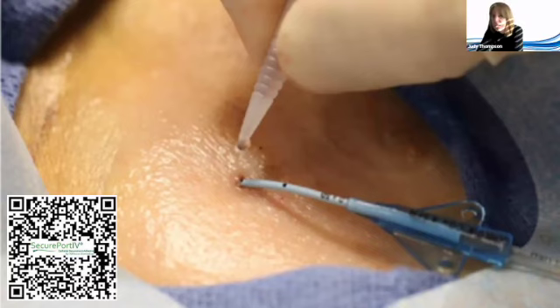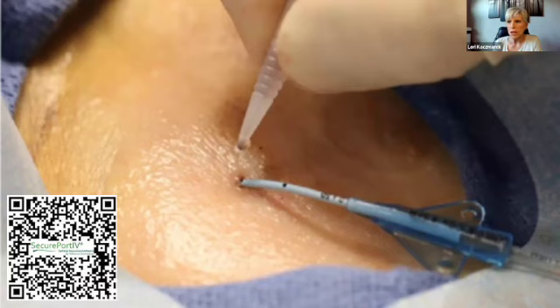Good. Is there a time limit for application from insertion? Can it be applied a few days later? Absolutely. A lot of times, for example, a hospital that's receiving a patient from an outside facility that did not apply tissue adhesive, absolutely, when they're doing that dressing change, put that glue on there. You want to protect that catheter. So there's no time limit. Ideally, you want to put it on when that catheter is inserted and start protecting it from ground zero and throughout the life of the catheter. But if that patient is in that situation, absolutely.